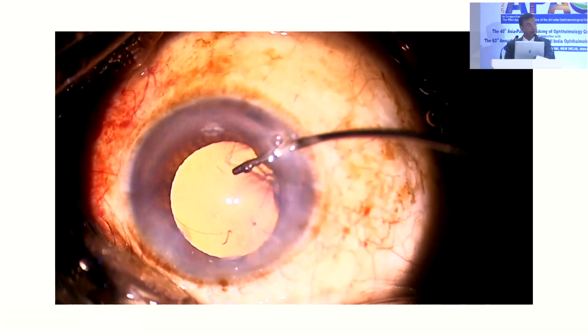So what should we do now? David, you want to sort this out for me? That bag is officially dead. I wish I had that CTR injector you have, but I don't have it. No. Well, I don't think the bag's worth any support at this point, other than maybe holding back the hyaloid face, but it's going to contract and crumple up. So I think you're going to have to plan on how to put the lens in without capsule support. So glued IOL would be an option. Good option. And then maybe you'll be able to grab the bag and extract it with forceps without doing a vitrectomy.